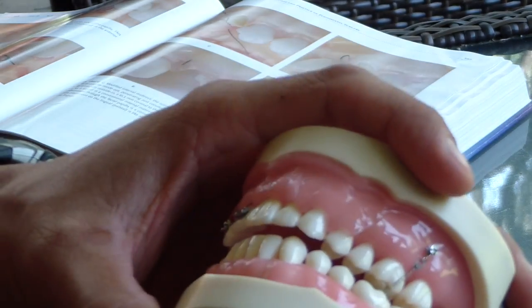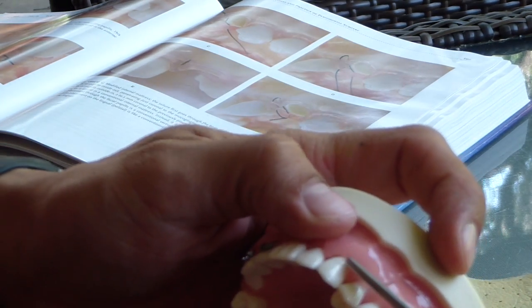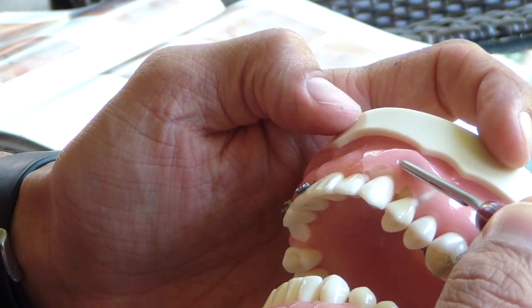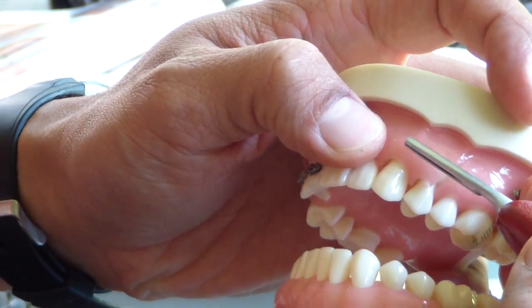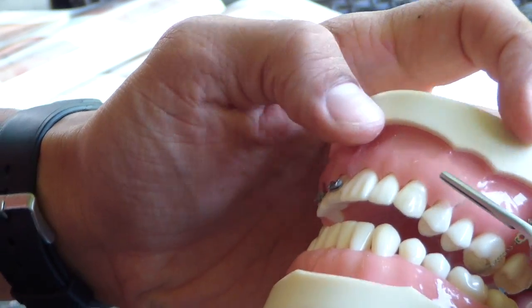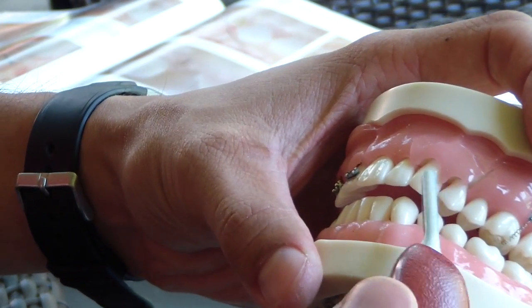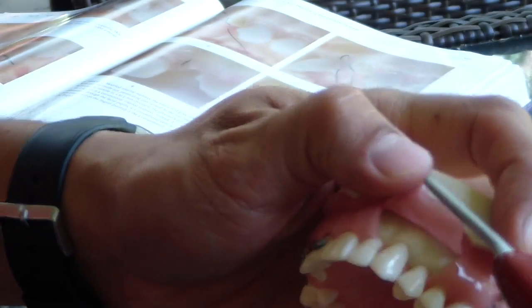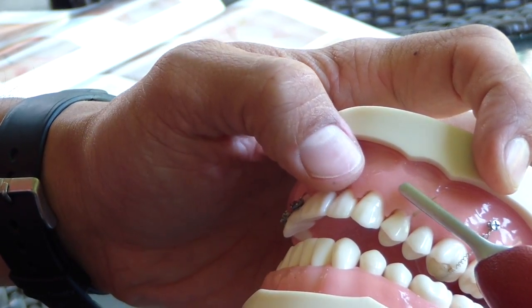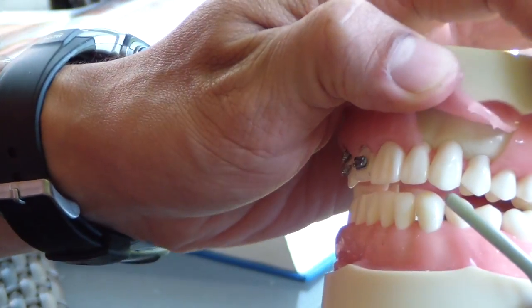So say you have a patient that presents with a recessive defect on their canines — it's a classic spot, anteriors. So you've got recession on the canine, and there are a thousand different ways to coronally reposition that flap. In one technique, you use a couple of vertical releasing incisions, elevate the papillas, place your connective tissue, do your root bio-modification, and then replace your facial flap. The papillas on the palatal side are still intact, so you can see them poking through the interproximal region.